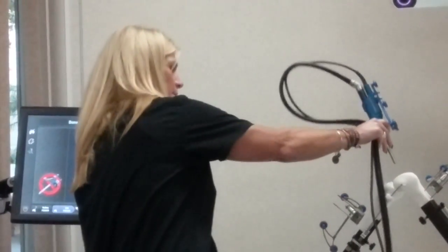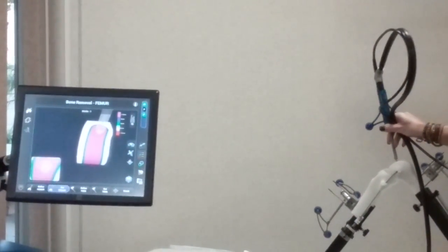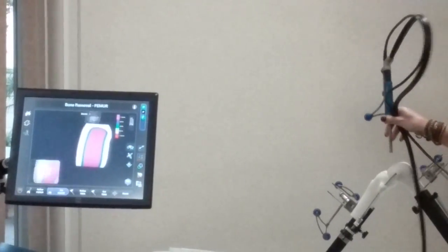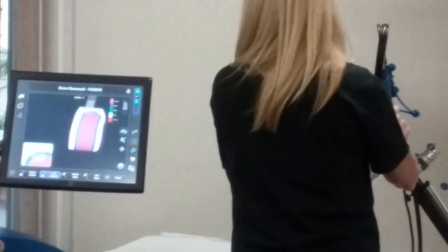So I don't know if you guys can see this. When I come in, it's coming out. Yeah. And then for you guys over here. And if I get away, it retracts away. Wow. Alright, so I'm going to come in, and I'm going to start burring down.